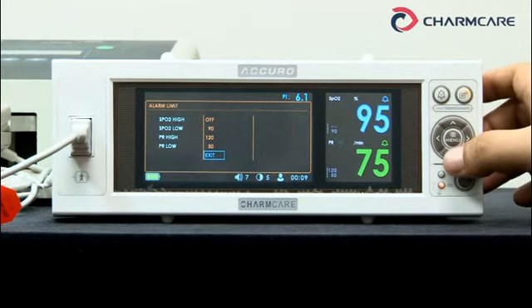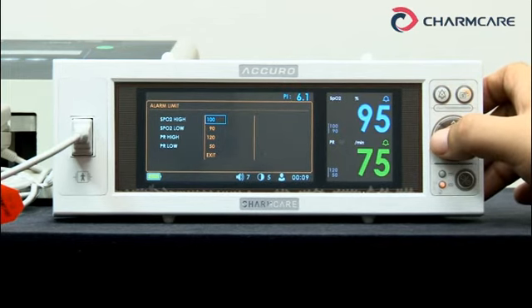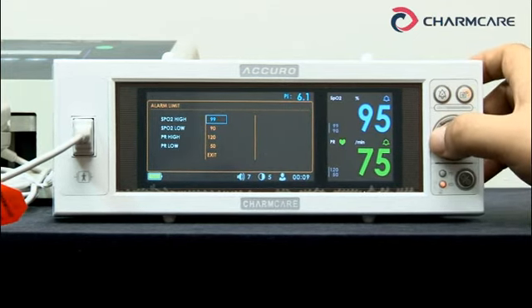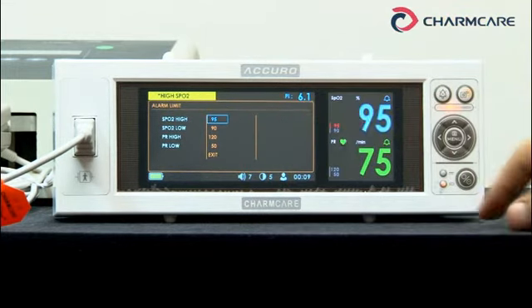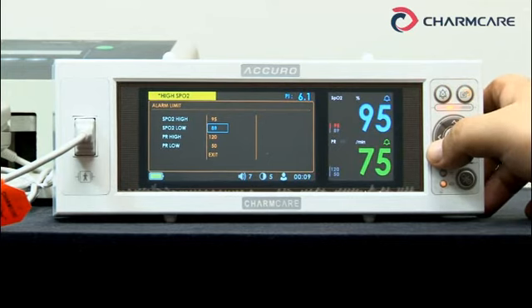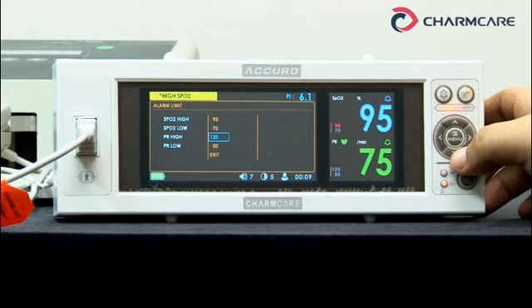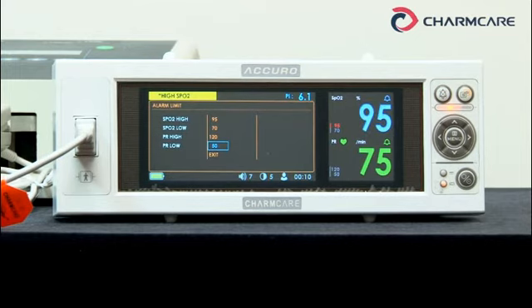Alarm limit — press this button to get into the sub-menu. SPO2 high: sets the alarm upper limit for SPO2 value — now it's 100. Let's change it to, for example, 95. You can see the yellow part appears — it's a visual alarm and sound alarm together. SPO2 low: sets the alarm lower limit for SPO2 value. Let's make it 70. Pulse rate high: same as SPO2, sets the upper limit for pulse rate. Pulse rate low: sets the lower limit for pulse rate — you can change the value here.